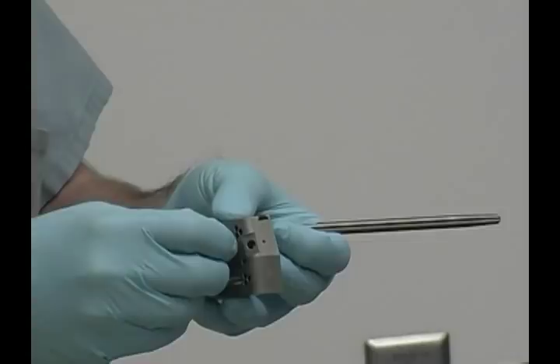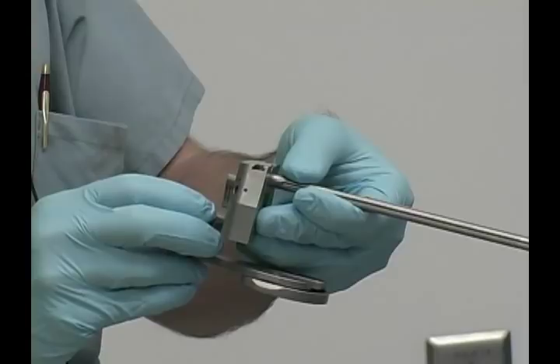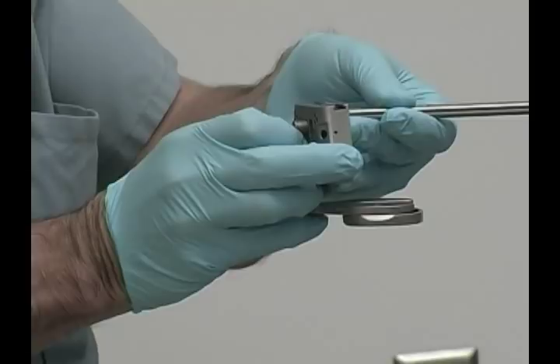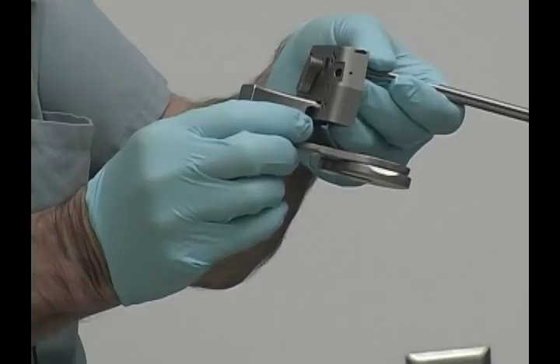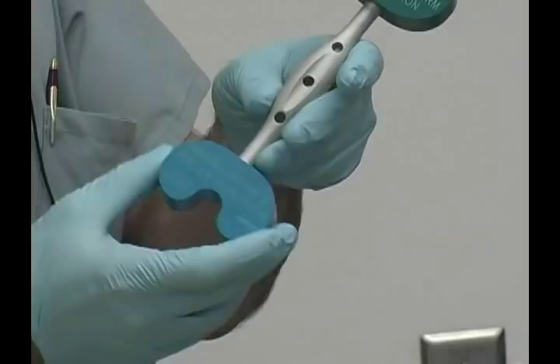The blocks are free to translate and rotate around the axis of the IM rod. The balancing tools are very similar to the LCS and are a little simpler to use. They're done after the femoral resection, which provides stability of the block. The femoral distractor easily fits into the slot on the back of the balance block and allows you to translate it up and down on the IM rod to set the flexion space based upon a balanced resection technique.